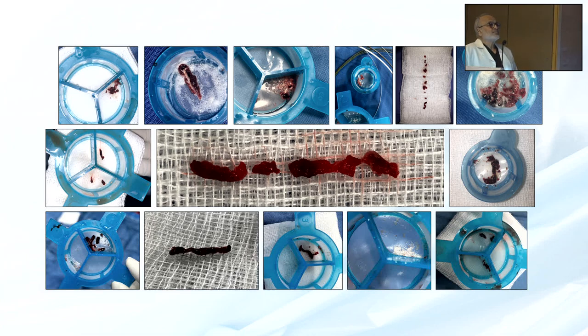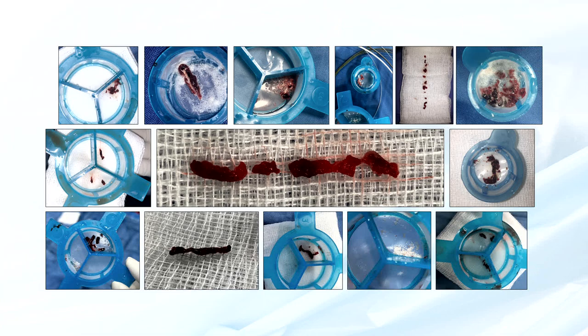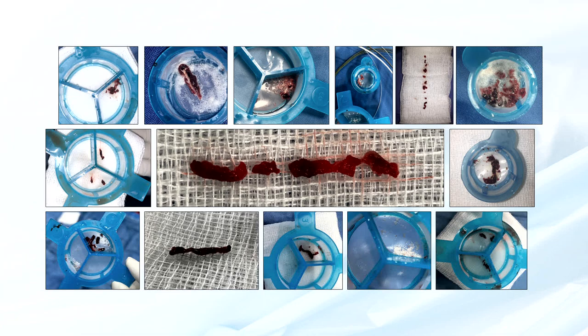Well, for aspiration, we can use mechanical aspiration, in the United States we do that, the RX catheter, that is a suction catheter, can do that. And extension catheter, I think working well too. So a lot of time, with the anatomy, the RCA tortuosity, it's difficult to get your guiding catheter done. I think extension catheter can do this really reasonable job. Yes. Okay, I agree with that. The extension catheter will be effective in the same manner.